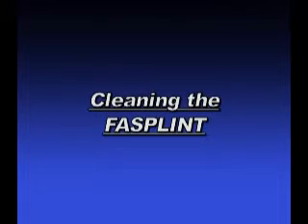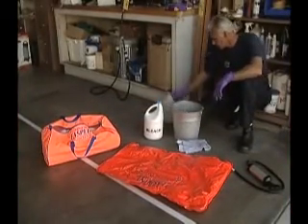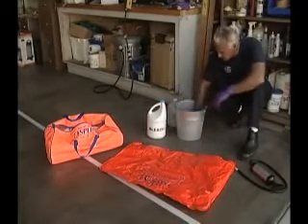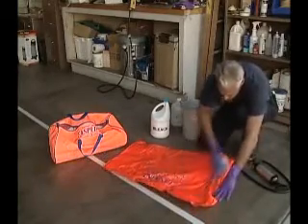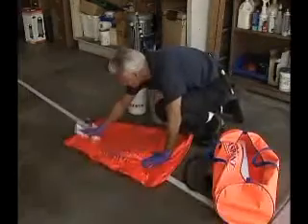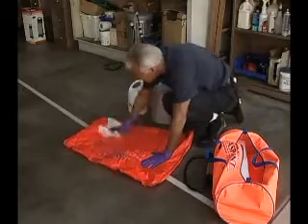Clean and disinfect the fast splint according to your medical director's guidelines. We recommend that the fast splint should be cleaned using soap and water, a mild detergent, or a commercial cleaner disinfectant. Bleach solution will not harm the material. It should be thoroughly rinsed off with lukewarm or cold water and then allowed to dry. Make sure all the splints are completely dry before placing them back into their storage and carry case.